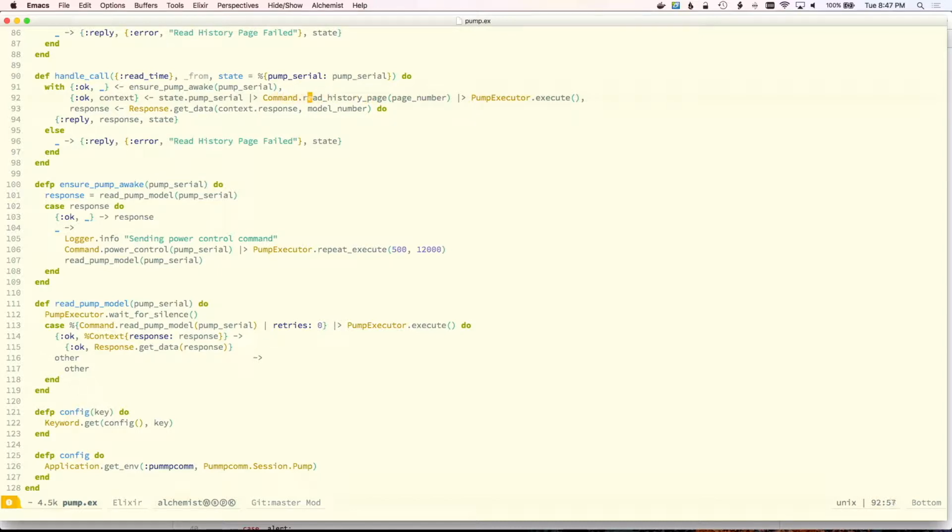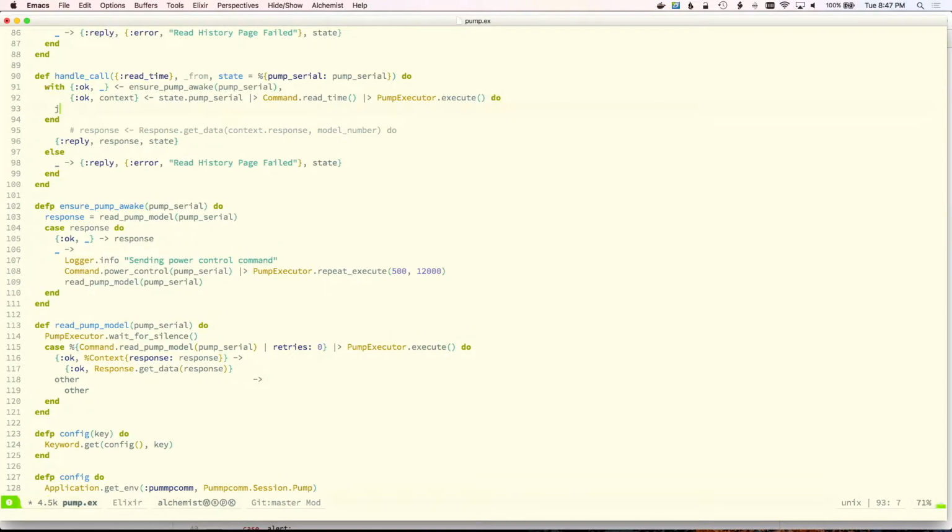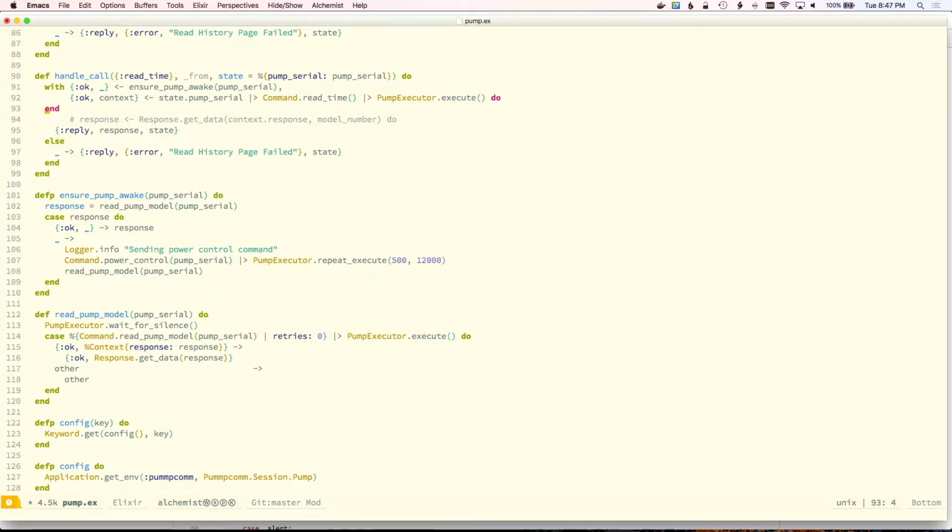So I'm going to create a command for this read time, or I'm going to call this command and execute it. And I'm just really curious about what I'm going to get here. So I don't really have a response. I'm not unwrapping that thing at all yet. So I'm just going to comment that out and then inspect what I've got at the end.